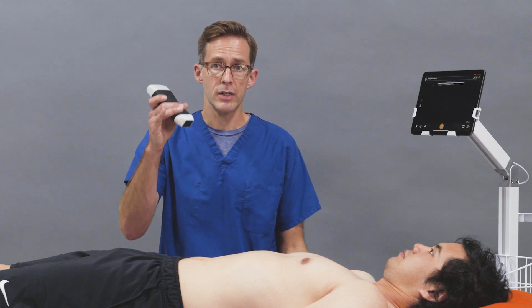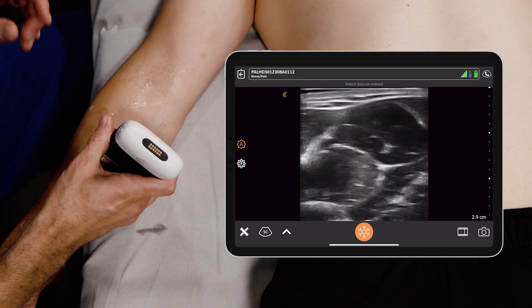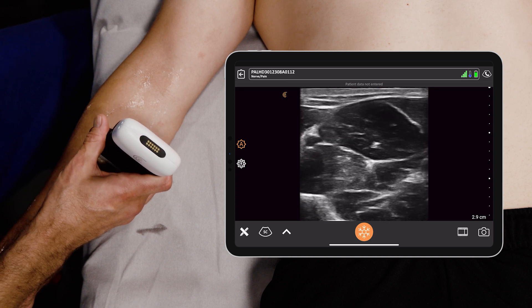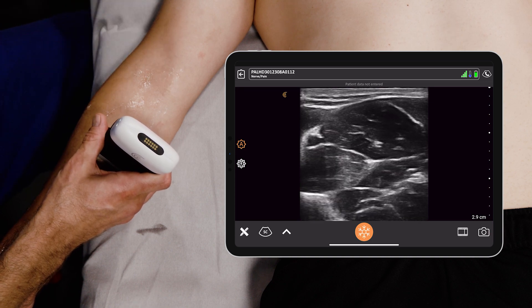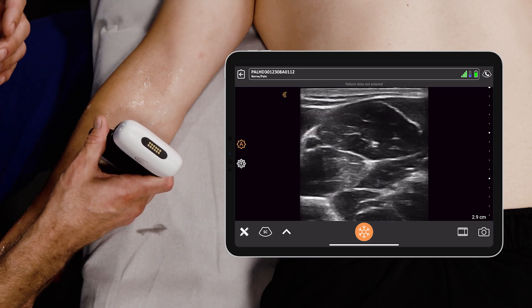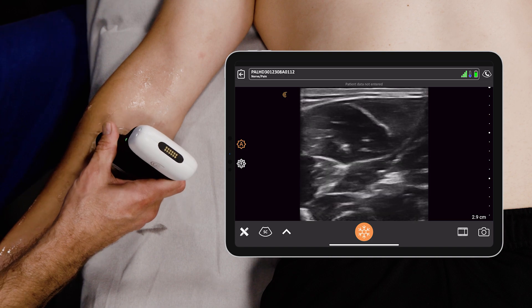I just take the ultrasound probe and go to the mid forearm. The adage with forearm nerve blocks is there are three of them: the radial nerve, the median nerve, and the ulnar nerve. The ulnar nerve, which we're looking for today, sits ulnar to the ulnar artery, much like the radial nerve sits radial to the radial artery.